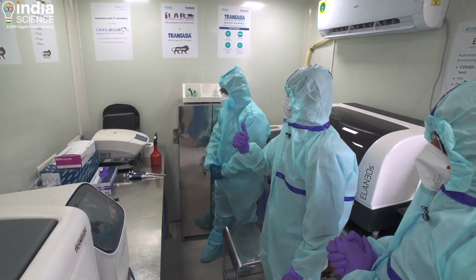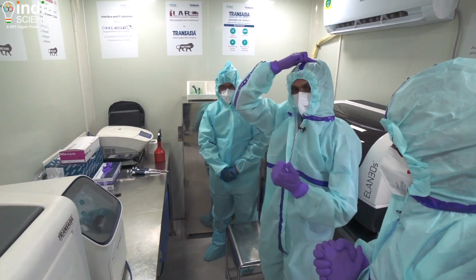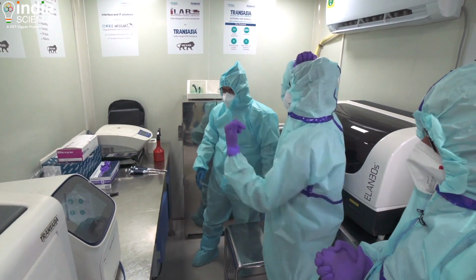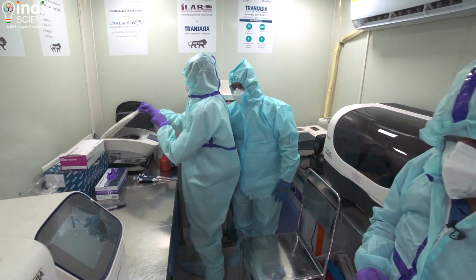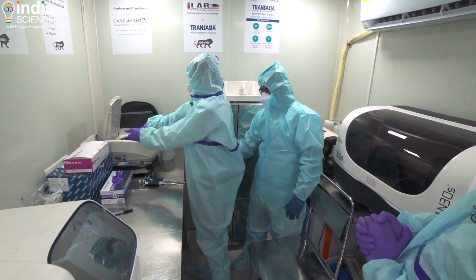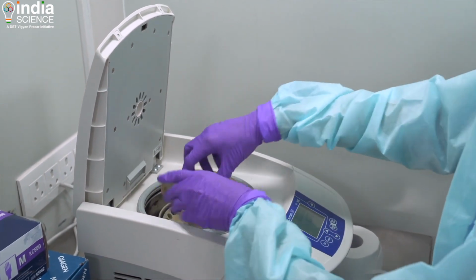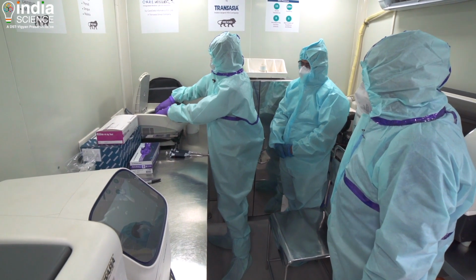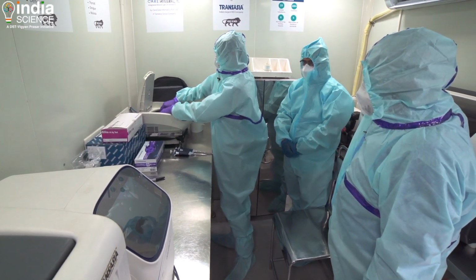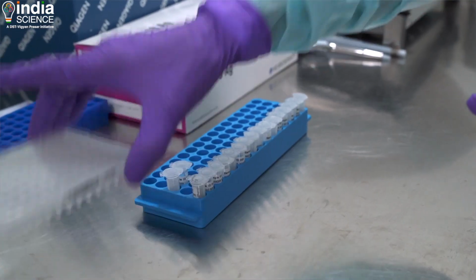So Imran and Dinesh together do this every day for hundreds of samples. So how do they do it? The samples that come here are processed at a set speed. As you can see here, you keep the tubes here, then you close it, then you start centrifugation. This pellets down the RNA that is present in the sample, and we line it up here.